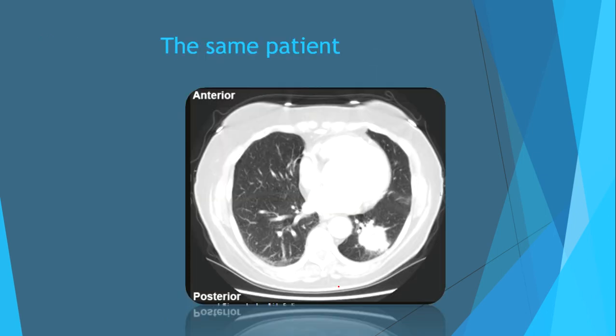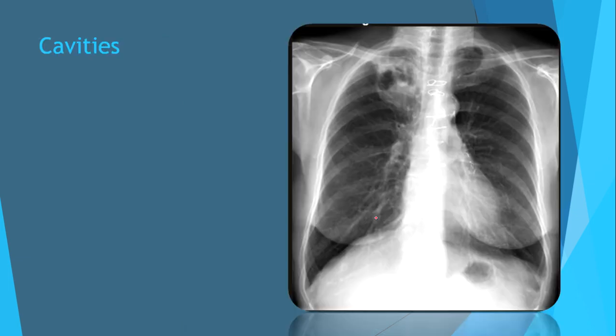This is the same patient, but on the CT scan we can see this tumor with metastasis in the lung nodules. Cavities. I give you a few seconds to understand where the cavity on this film is placed.